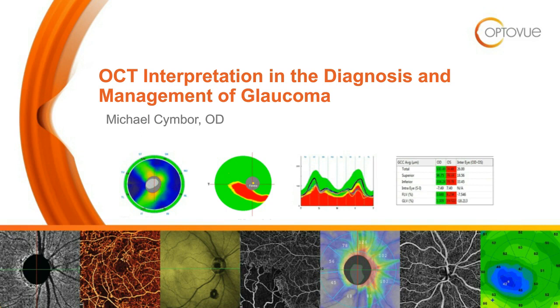Tonight, we are pleased to introduce Dr. Michael Cymbor of Nittany Eye Associates, who will discuss how to utilize OCT and OCTA in detection and management of glaucoma. In this session, Dr. Cymbor will explain how to interpret OCT scans, how to assess change over time, and how to evaluate vascular changes with OCT angiography.